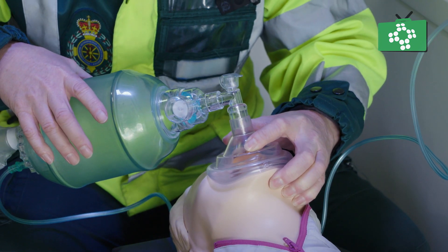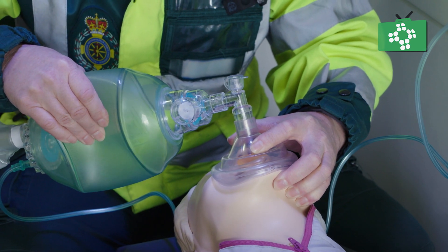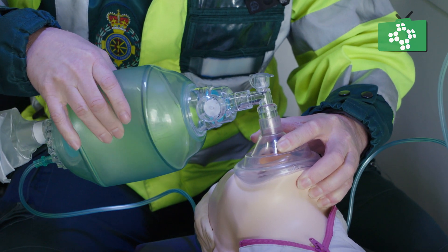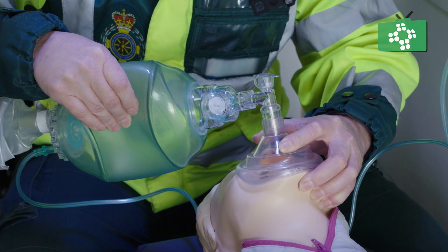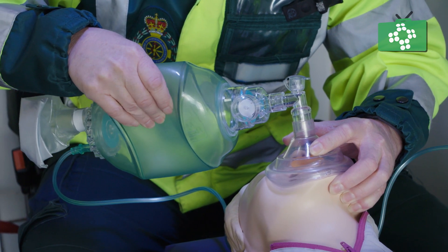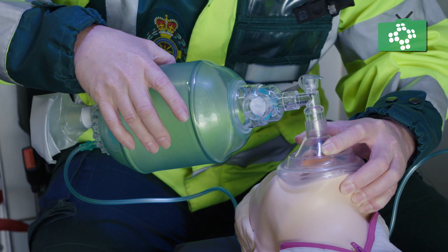Tilt the head back, and we should look at a normal respiratory rate — a ventilation rate for an adult would be approximately once every five or six seconds.